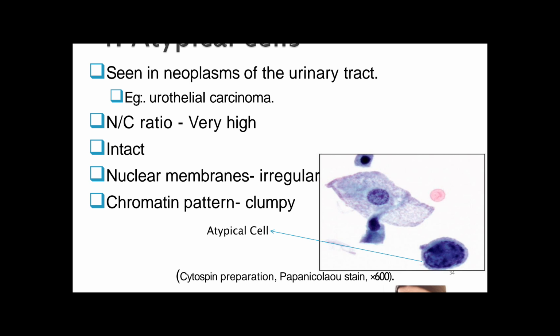So when we consider the atypical cells, here the NC ratio is high. Normally the cells are growing, undergoing mitosis and then they mature. During maturation, in immature cells the nuclear size is larger. When it is matured, the nuclear size is reduced because the chromatins are packed.